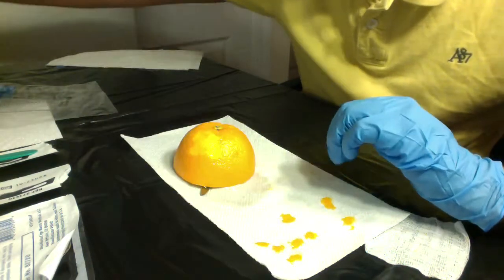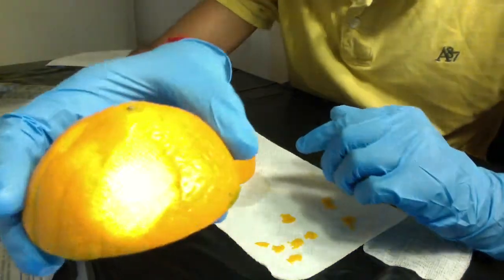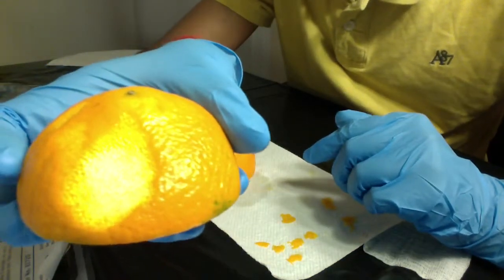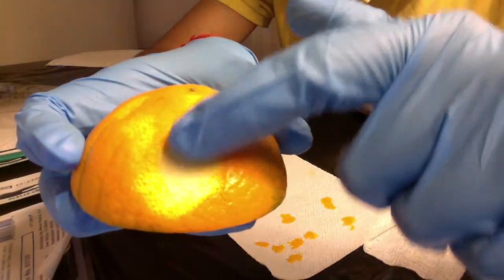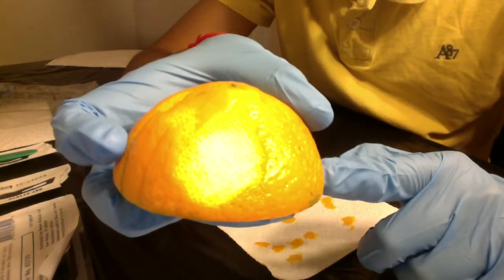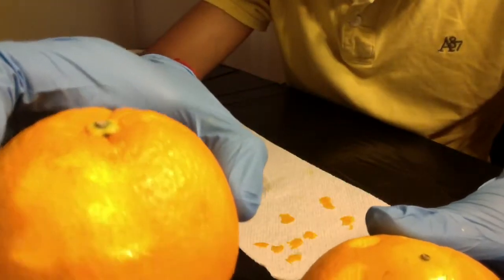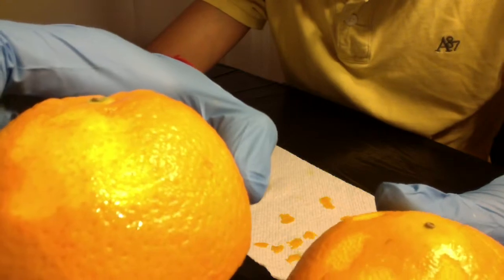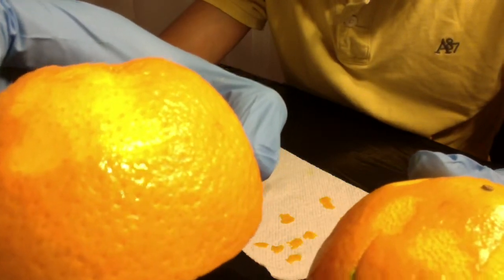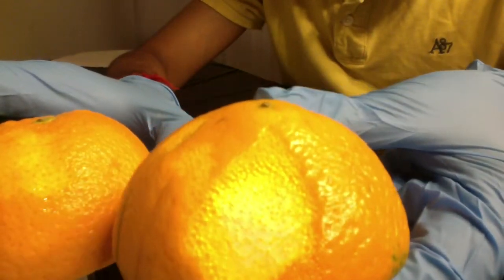Yesterday I was practicing on an orange, and I made a couple of deep wounds which shows the white meat aspect of the orange, and this is compared to maybe some progress today on the orange. This is today's orange, and this was one I used yesterday.